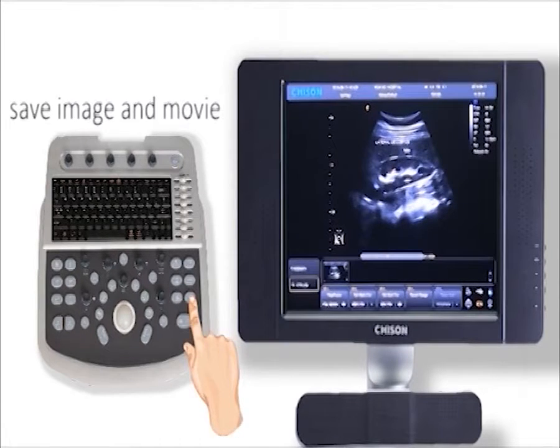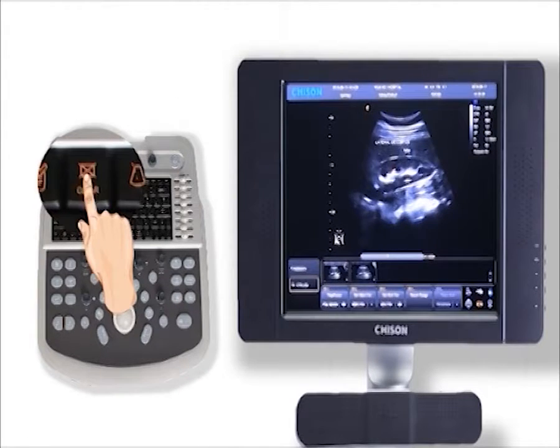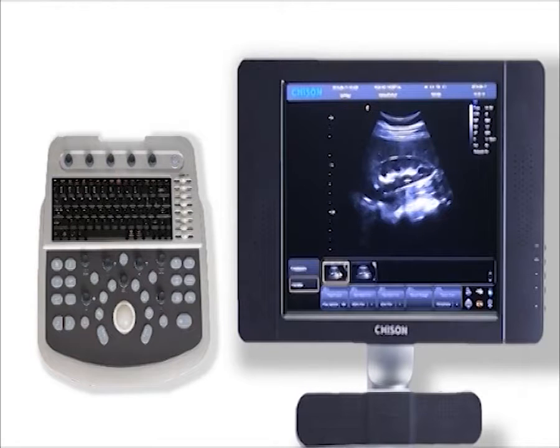Press this key to save still image. Another key is to save movie. They will be displayed at the below area. Press clear key to delete wrong measurements and comments.